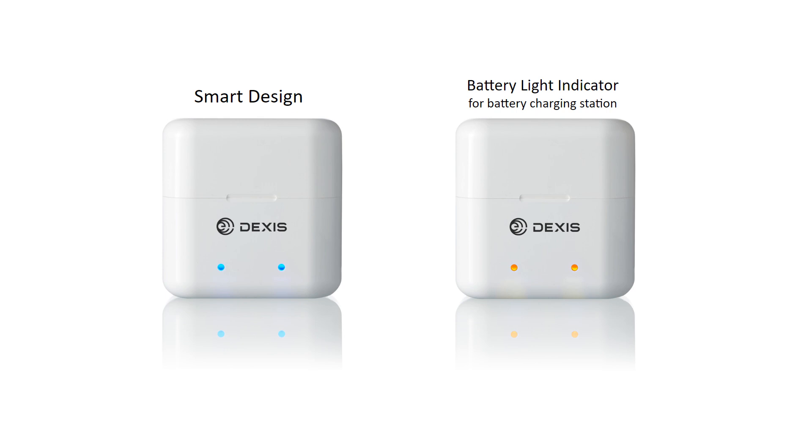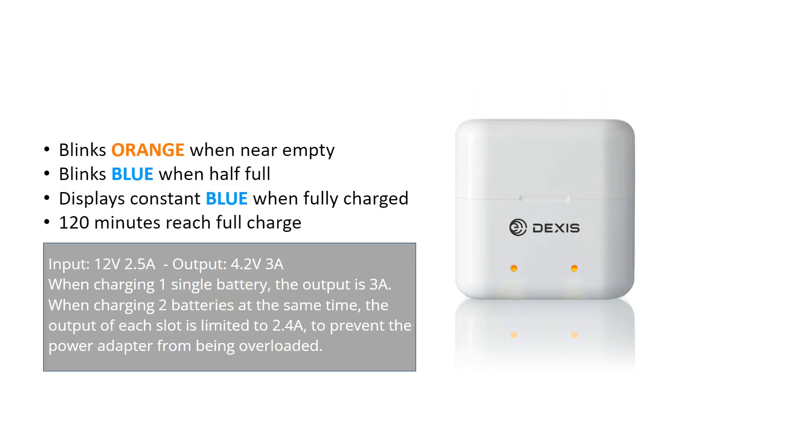The scanner battery charging station, an optional accessory, can charge up to two batteries at the same time. The indicator on the battery charging station blinks orange when the battery is near empty, blinks blue when the battery is half full, and displays a constant blue when the battery is fully charged.